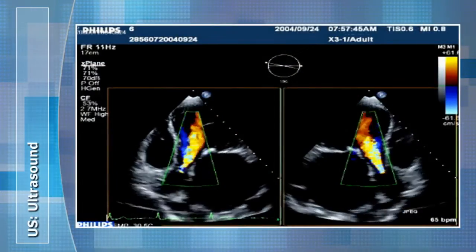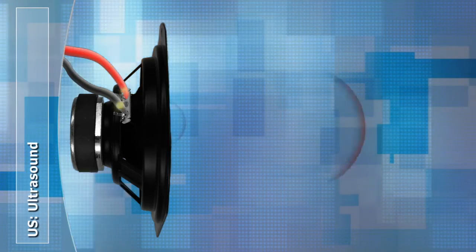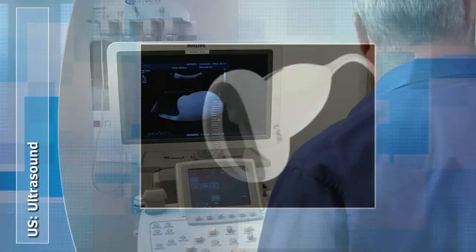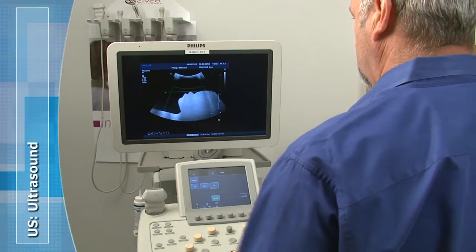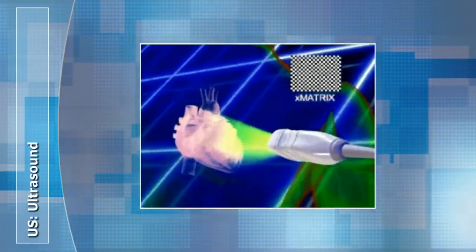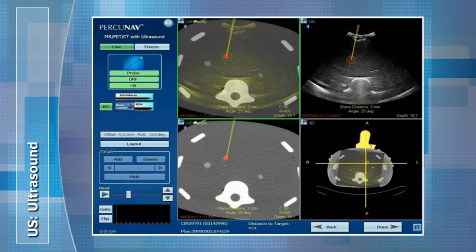Ultrasound, on the other hand, needs no such radiation. It uses high-frequency sound waves and highly sensitive receivers, or transducers, to create its images. You're probably most familiar with ultrasound in the prenatal ward, although today's devices can be used to detect heart defects, blocked arteries, and even discover abdominal problems.